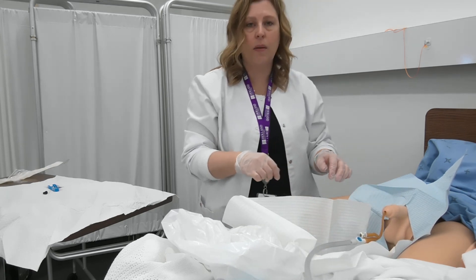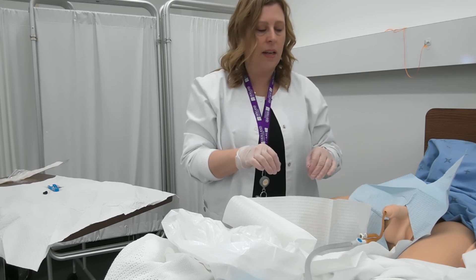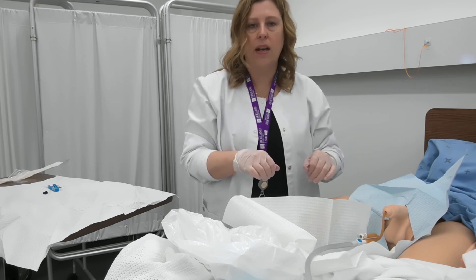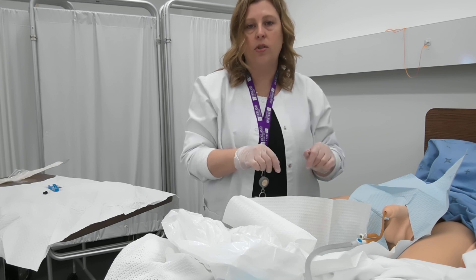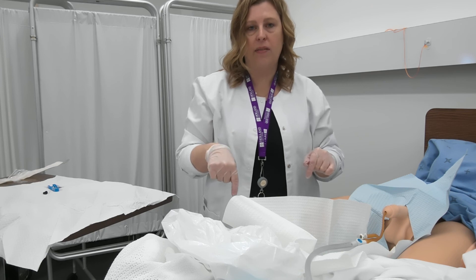Once that's complete, I want to make sure that I secure the catheter to the client's thigh. I'm going to remove all these items, give my client some perineal care, and then ensure that the catheter bag is attached to the frame of the bed below the level of the bladder.